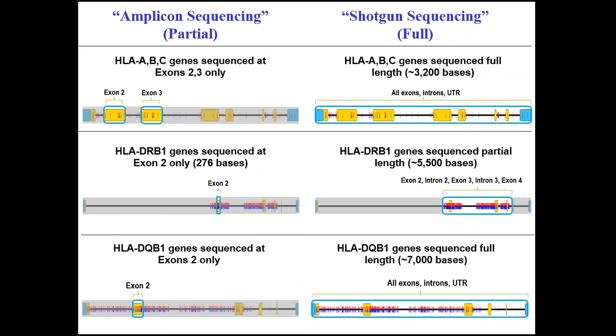This technology was adapted in our field, and different groups chose different approaches. Here we have an approach whereby the NGS technology was used, but it was used to characterize only exonic regions and not necessarily the whole gene, as it is on the right panel. Our approach from the very beginning was focused on characterizing the whole gene. We thought that the benefits of this technology would be utilized more effectively if we could sequence the whole gene. And therefore, we focus on doing exactly that.